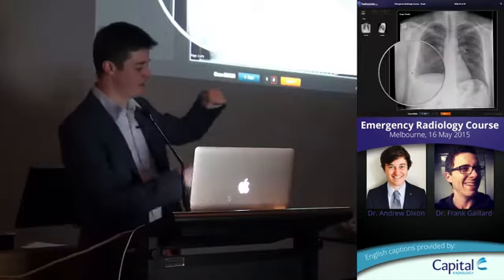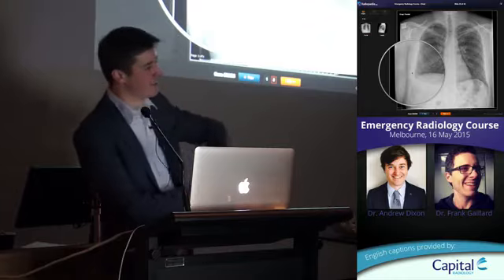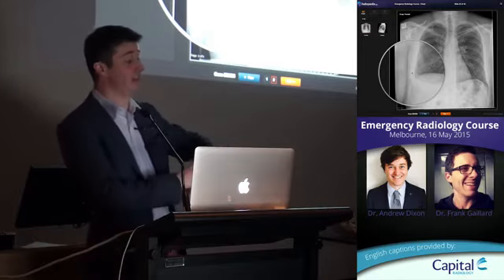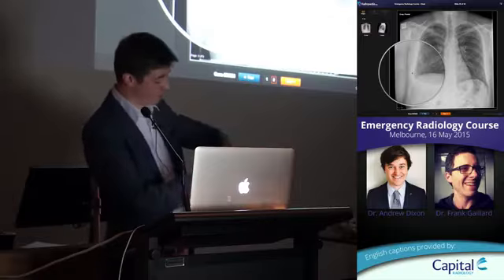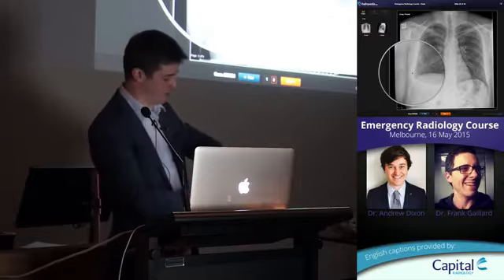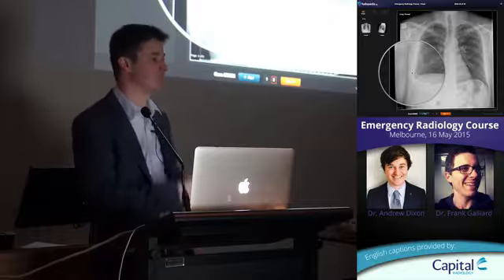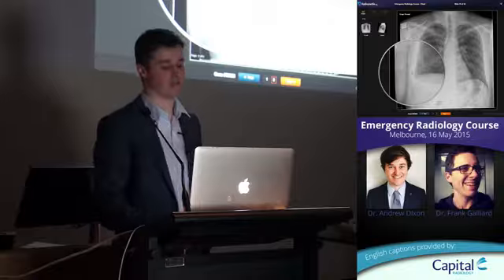If you've got a glass of water, and you stick your hand in there, the fluid comes up around your hand, okay? And if your hand was full of air, and you took an X-ray from the front, you're going to see the fluid coming up the sides as being more dense, but the air is going to be in the centre. That's why you get that meniscus kind of appearance.